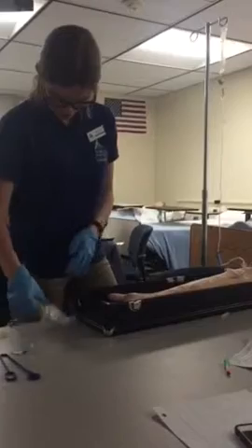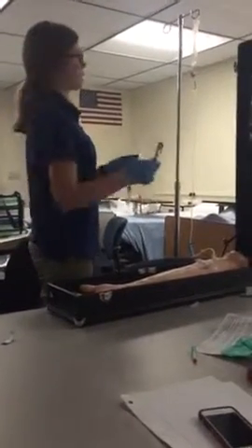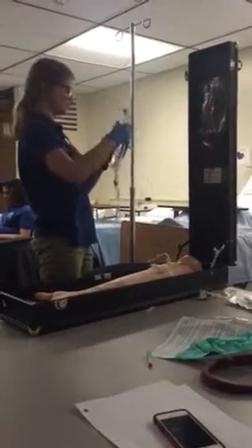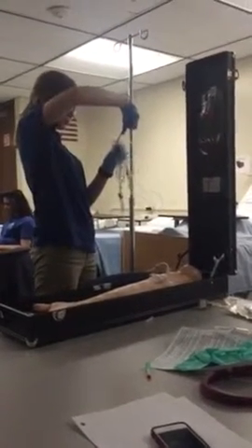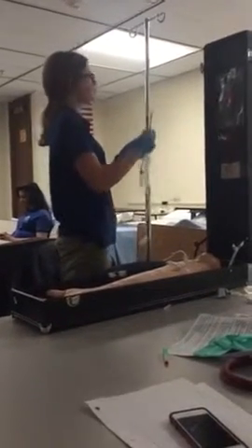I've already drawn up my 3 milliliters. So before you do this, you want your primary bag to be lower than your piggy bag. I have primed the tube and clamped it back off. I'm going to set it here while I wait for the rest, and then I am going to select my vein.